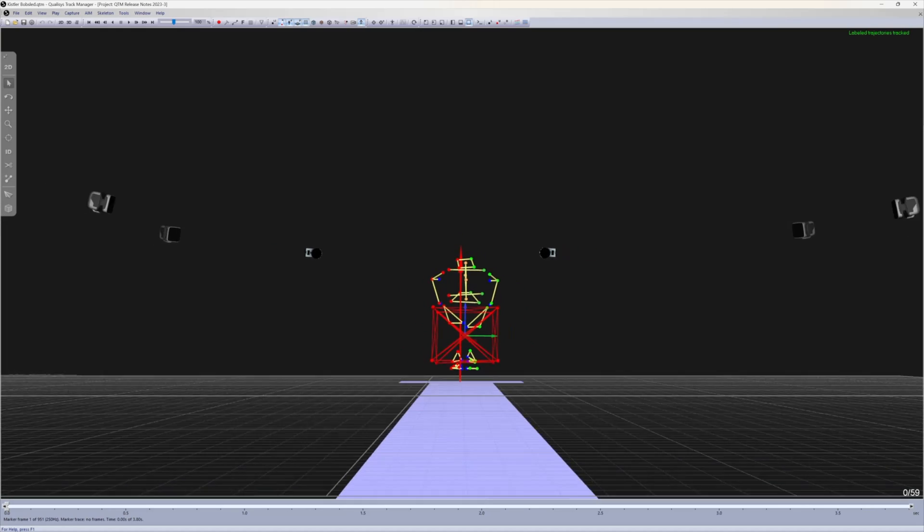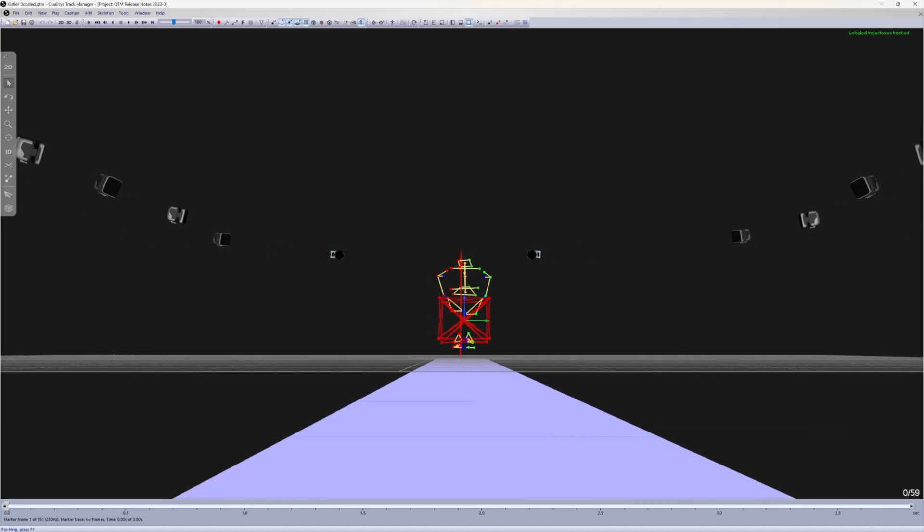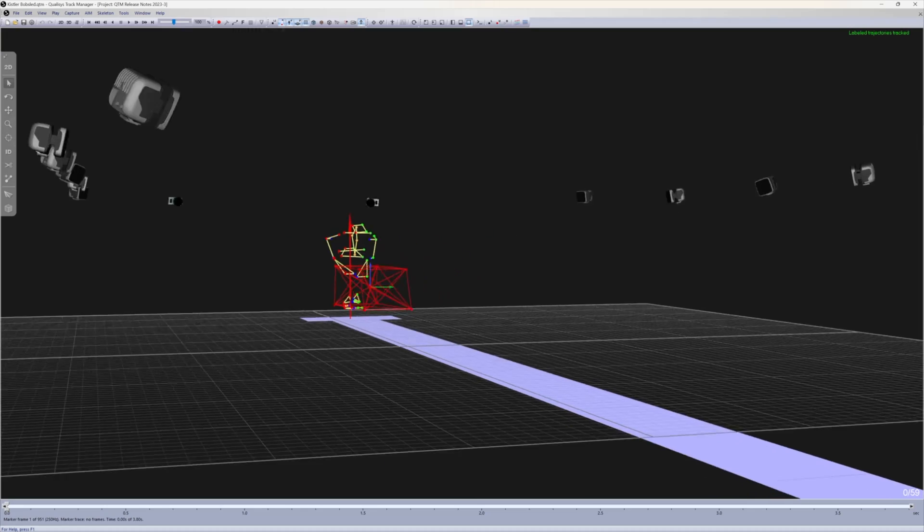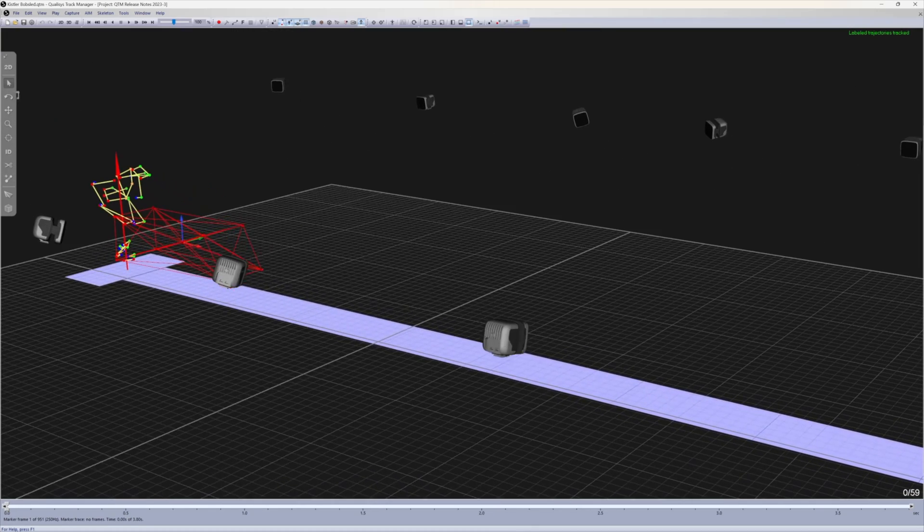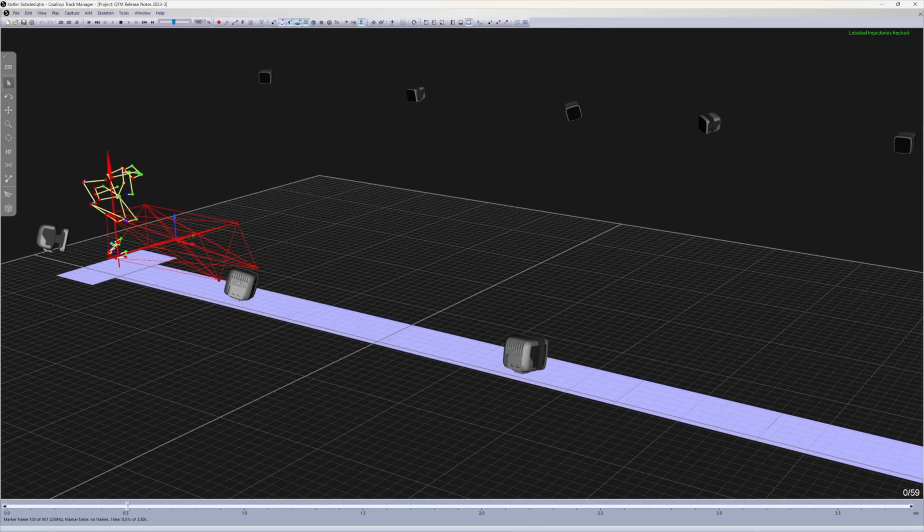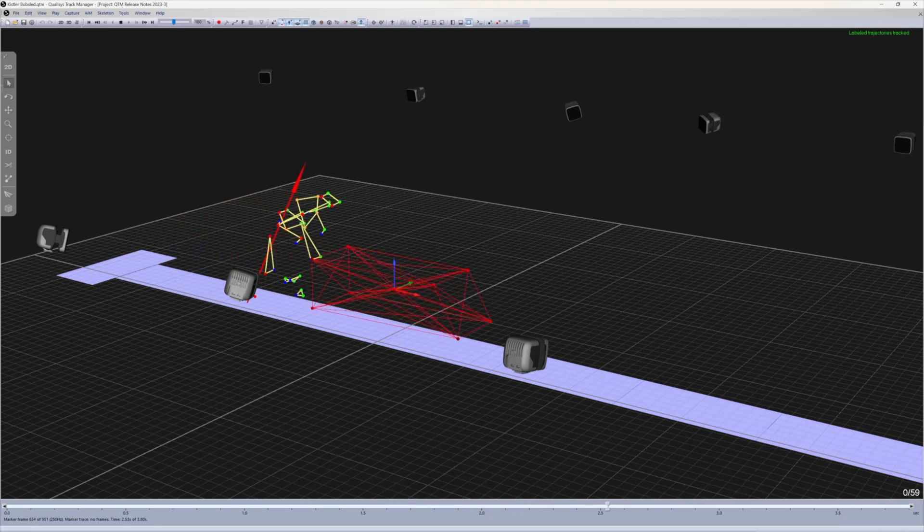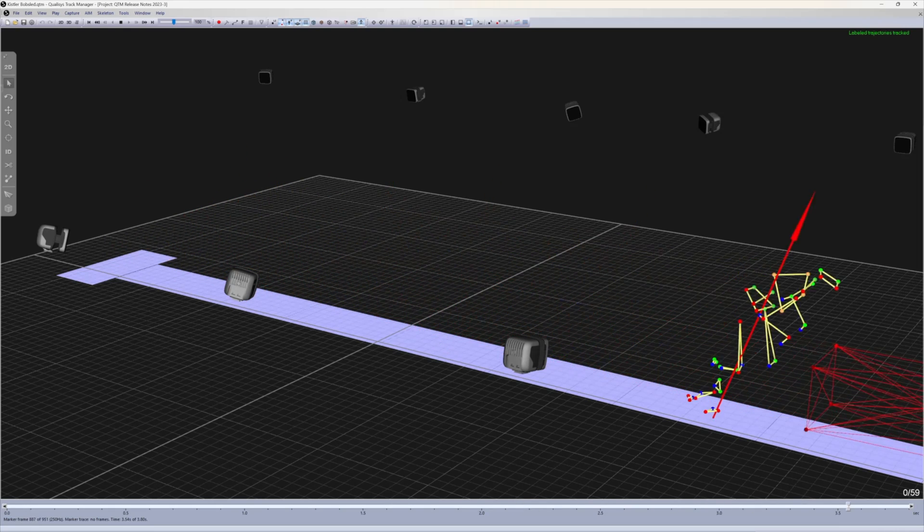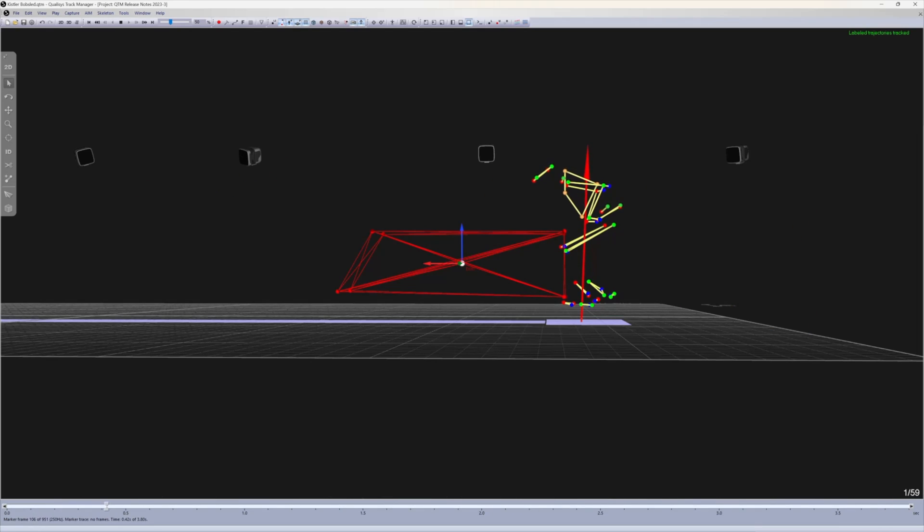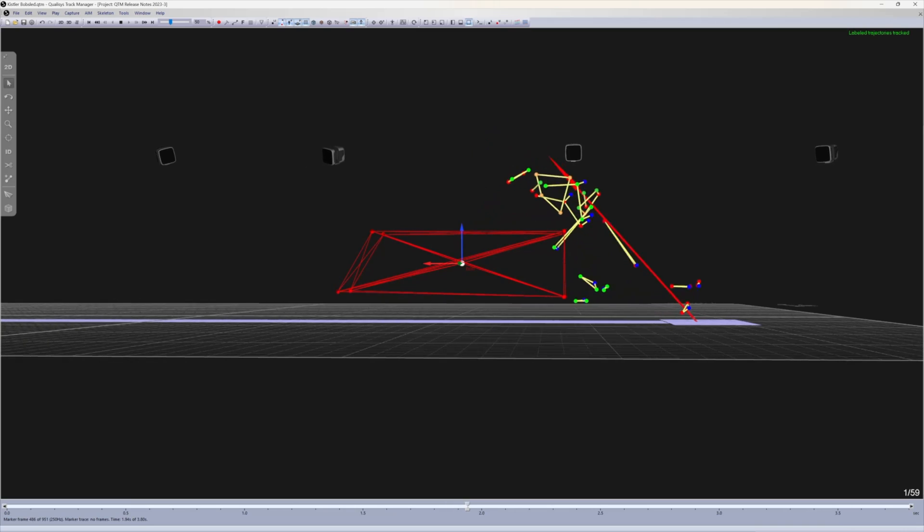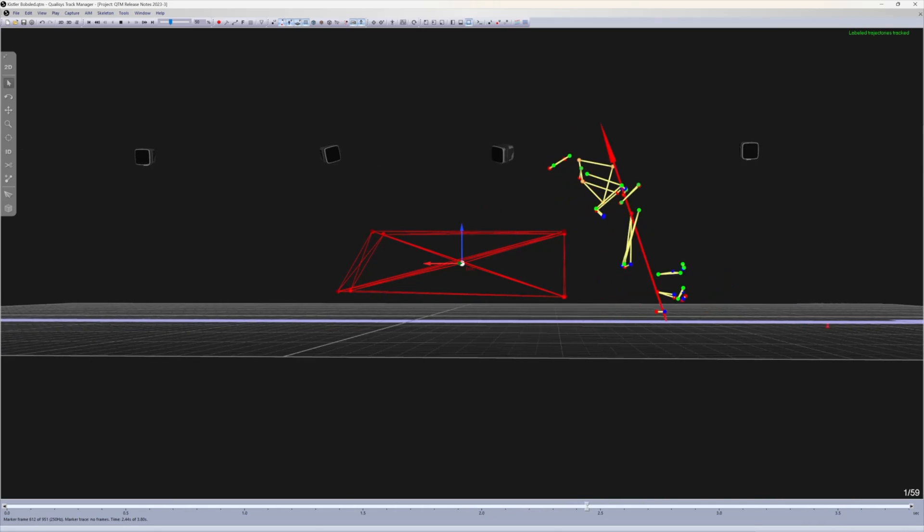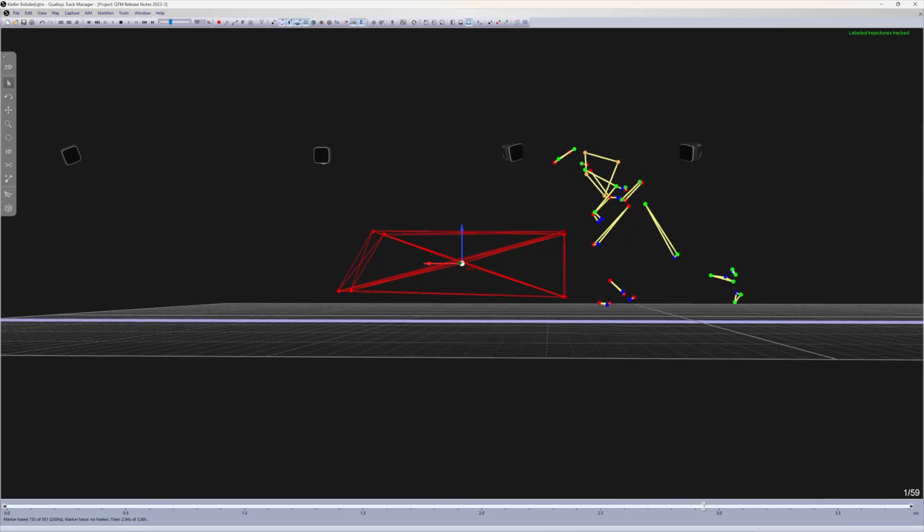The latest release of QTM includes new digital force plate integrations. Kistler force plates with digital output are now supported. Because QTM can receive digital data directly from the force plates, the Kistler DAC box is no longer required, which simplifies the setup.